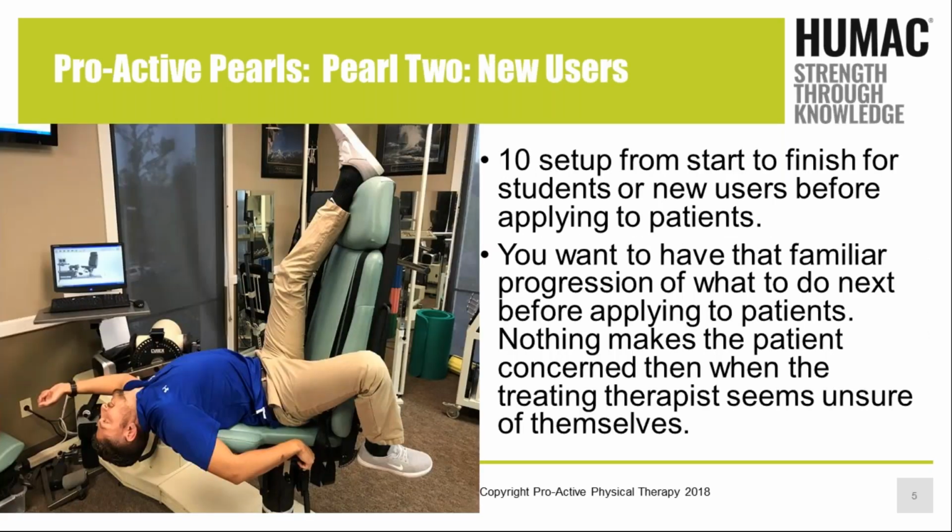Pearl 2 is, and Daniel mentioned this also last time, I like to see all of my students and any of my new users do at least 10 setups from start to finish before really applying to patients. Now, that doesn't mean that you can't adjust something for the patient that you're going through, but if you're going to be doing some testing or some training, you really want to have that familiarity with the machine and the setups so that you know what you're going to be doing with your patient. Because patients do get concerned when they see the therapist seems to be a little unsure. So, how are you setting them up and what are you trying to do with them is really what we're talking about. So, do that 10 setup from start to finish to make sure that you feel very comfortable.